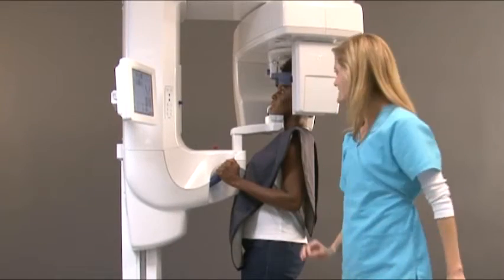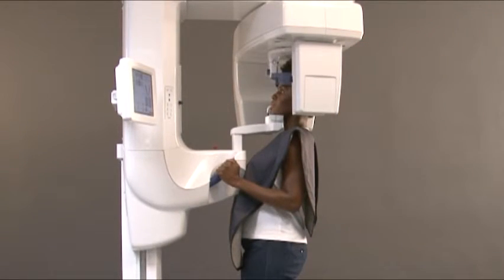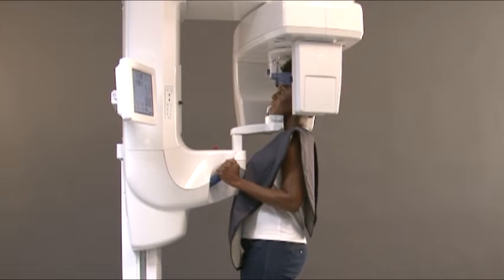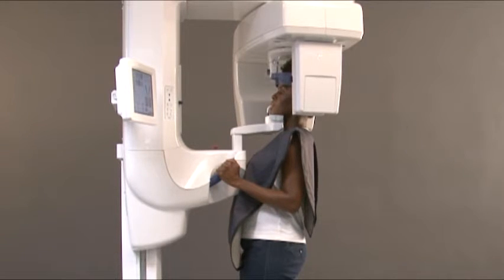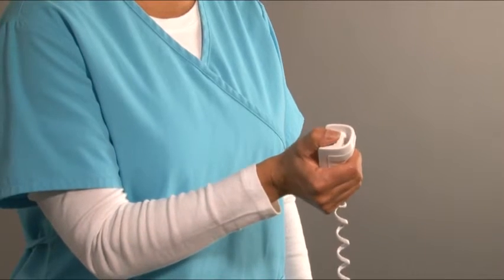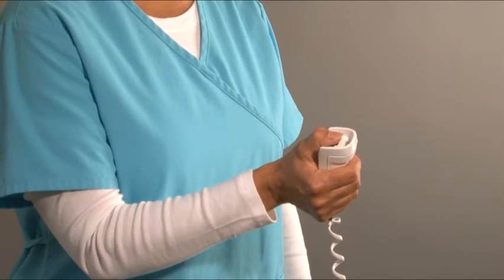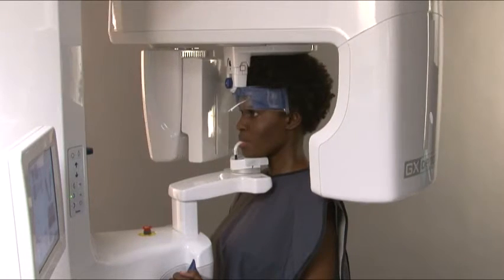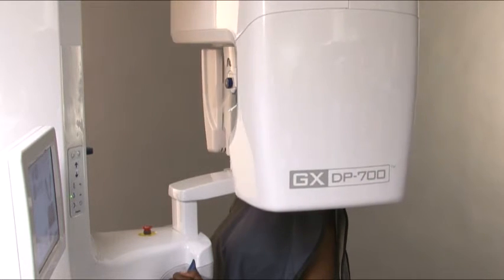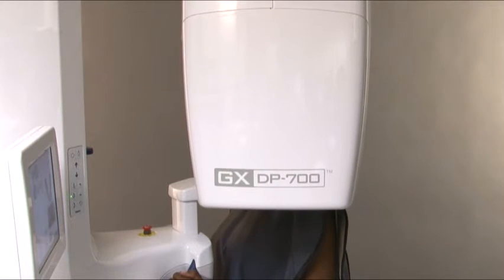Move at least seven feet away from the unit and protect yourself from radiation. Make sure that you can see and hear the patient during the exposure. Press and hold down the exposure button for the duration of the exposure. The rotating unit will move around the patient's head and then stop. When the rotating stops, the exposure has been taken.